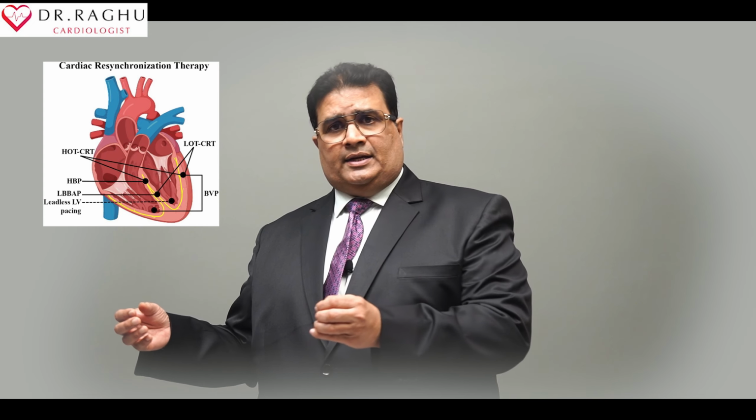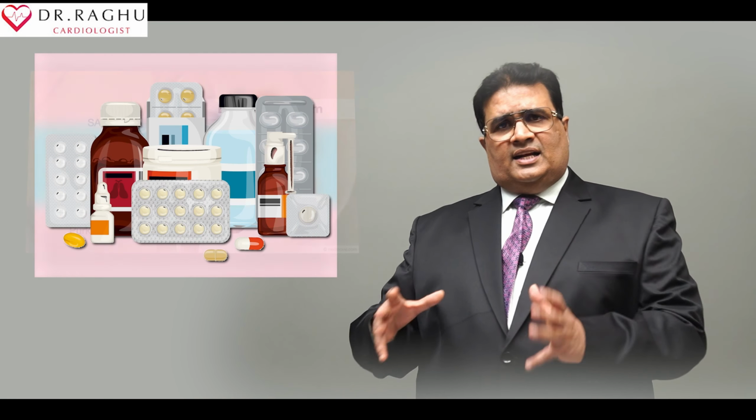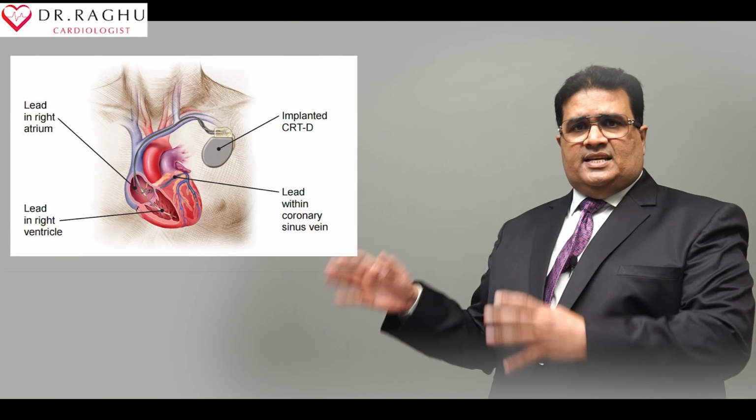Number two is the risk that patients who get the device without a clear indication might not get the best response. They might in fact be non-responders but still get a pacemaker. The ejection fraction improvement might not be there. The third thing we have to understand is that despite getting the cardiac resynchronization pacemaker, they need to continue lifelong medication. As we already know, pacing targets the electrical system of the heart, while drugs target the muscular system of the heart. We need to target both systems to strengthen the heart and bring the best possible outcomes from CRT-P therapy.